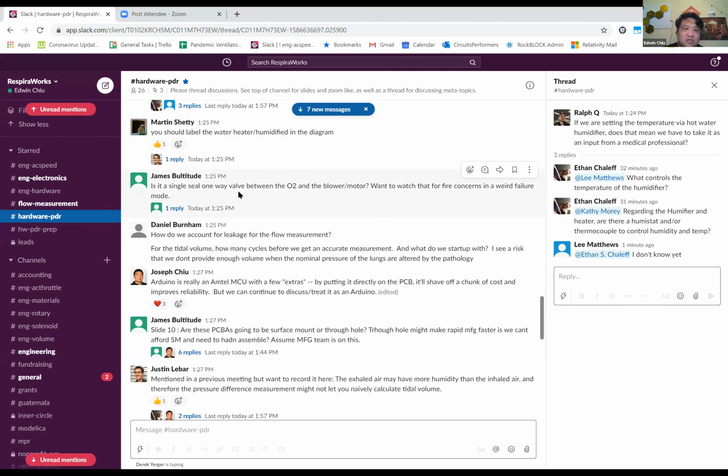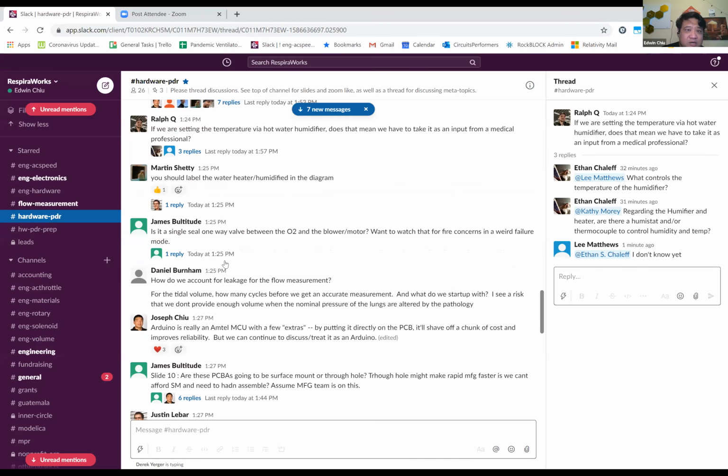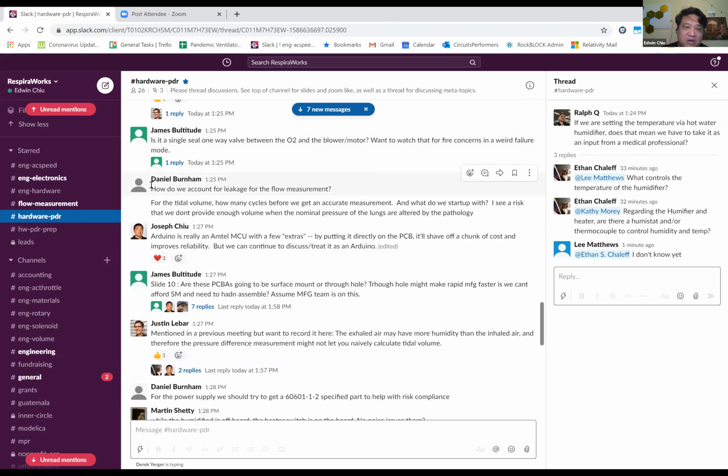Yep. And we have a physical model that was generously provided by Modelon in their compute. They've volunteered their computing software and generated a physical model for us so that we can model these kind of things. Also, one thing I forgot to mention earlier about the controller setup, the Arduino is just there because it's what we had on hand, and it really is just representing hardware. We don't need to use Arduino as a platform. At the end of the day, it's an Atmega microcontroller with supporting electronics, and essentially what we need is some kind of controller with supporting electronics. So that is up for discussion.